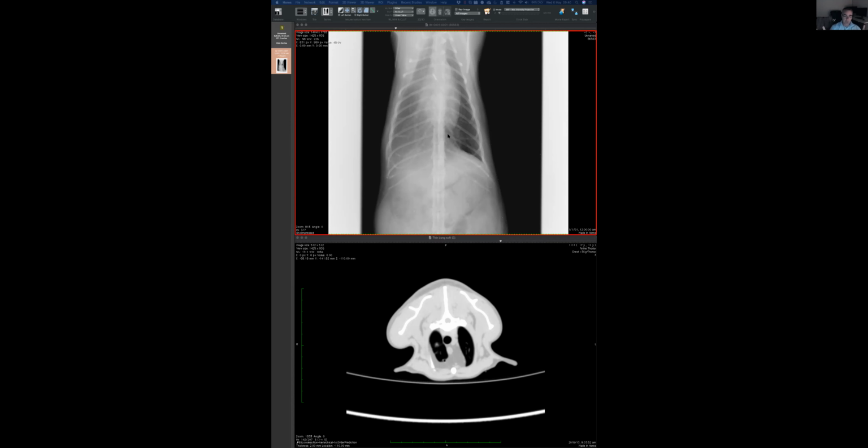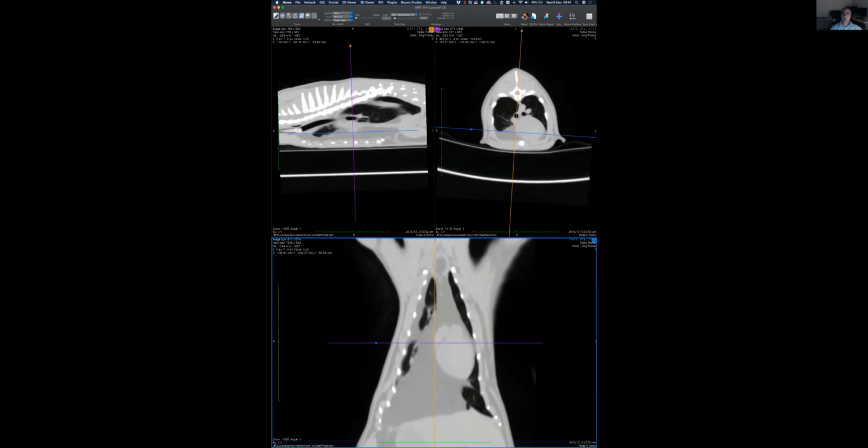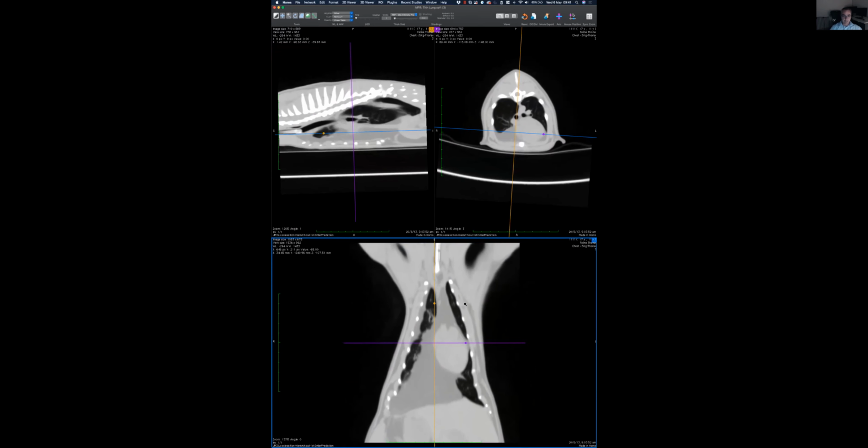Now the next question is, how can we end up with fat in that hemithorax behaving like this and not so much on the other hemithorax? Make sense? Now we understood the images, and now we need to make a story of how we can end up with that. Do you have an idea? Is it like a lipoma or a liposarcoma, a neoplastic or hyperplastic process? That is actually a good idea. It's uncommon, but it's a possibility.